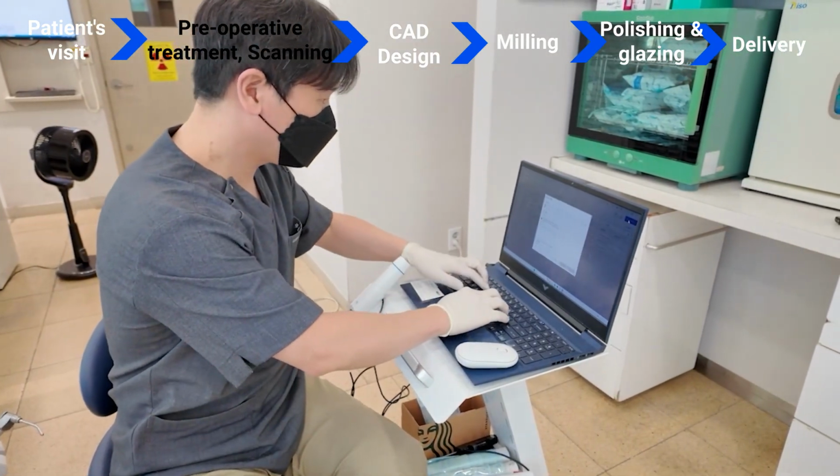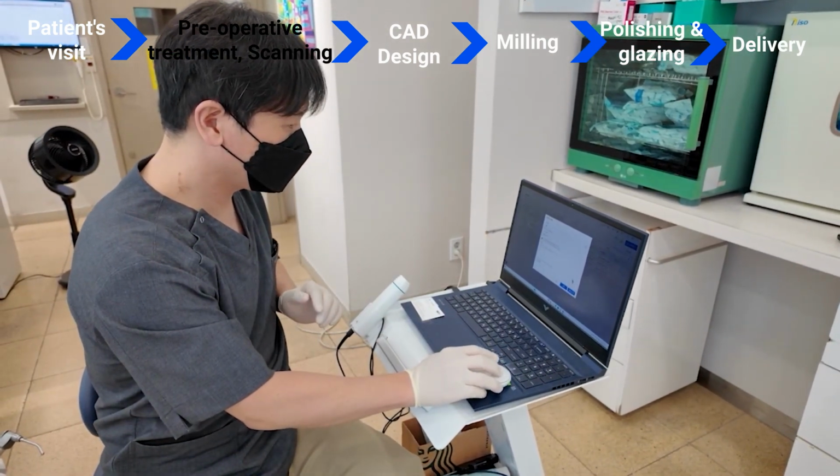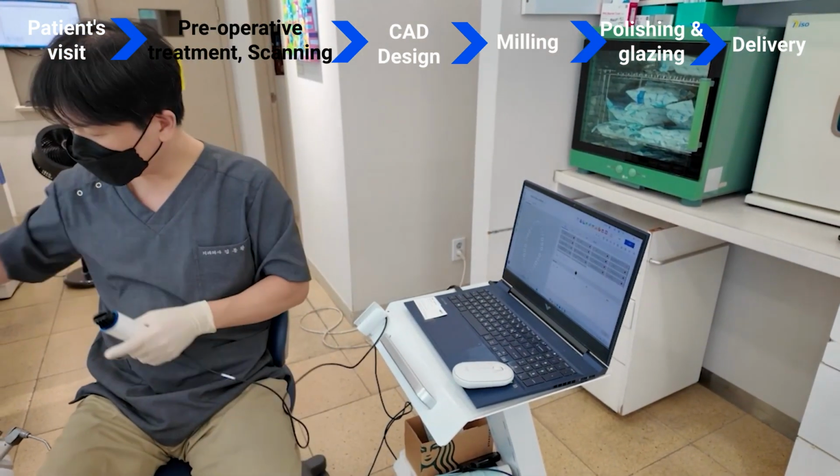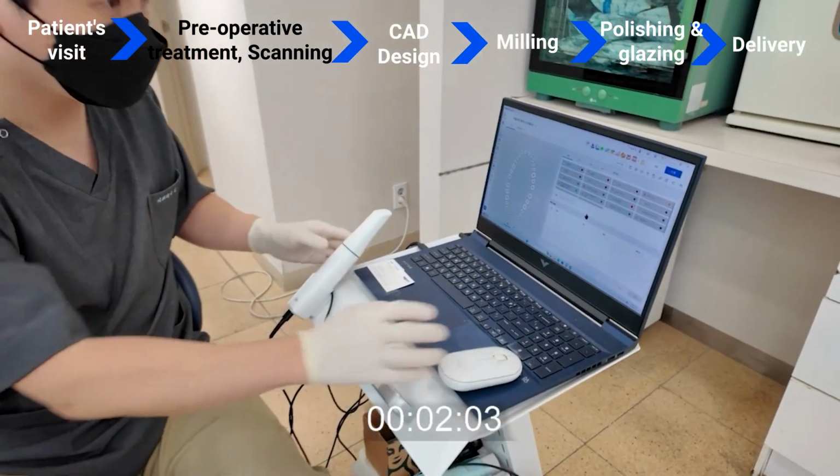Now, let's boot up the Medit app and create a case for our patient. We start with a diagnostic scan, which is super smooth thanks to the i900's wide field of view.